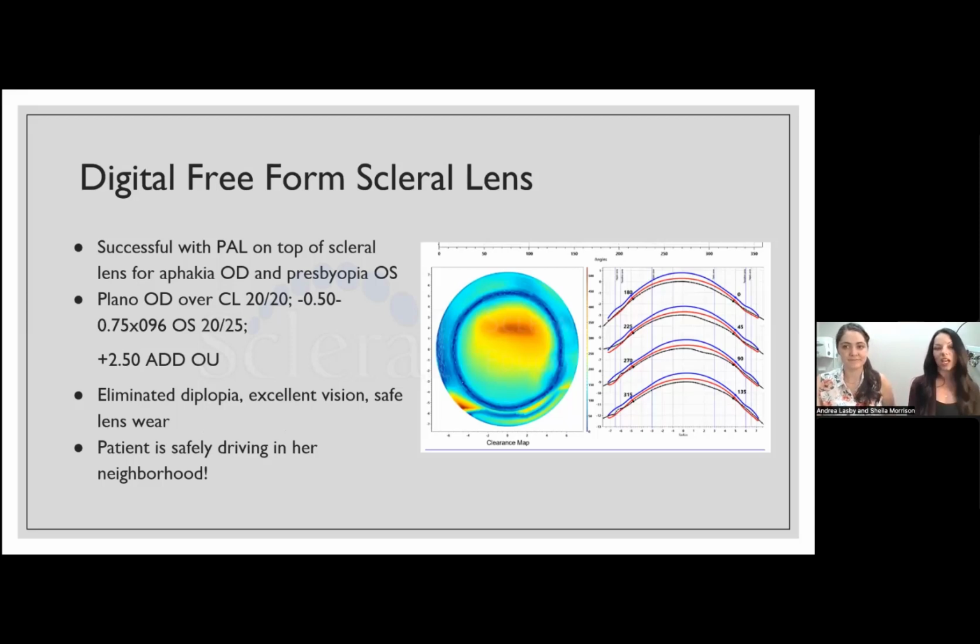But the bottom line, it can be useful if a patient's failing to understand why, and that knowledge of what those cells are doing can also help us to see what kind of stress we're putting on an eye that wears a lens. So doing endothelial cell count over time is sometimes helpful on eyes that are high risk, just to see if we are causing decreasing damage to the endothelium by wearing a lens. Although lots of corneas will decrease anyways with age and with other normal parts of life.